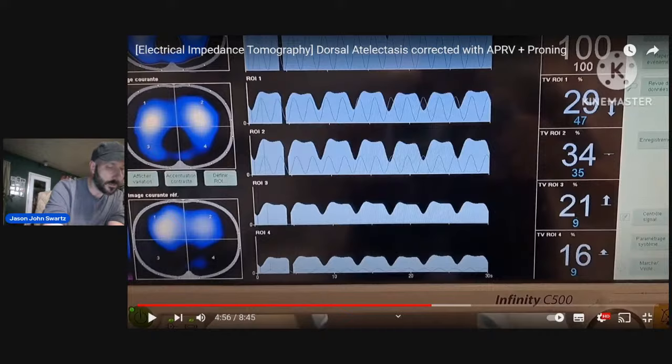When one's family was asking, when I'm talking about rest rate or something, I'm talking about the cycled releases. After the T high, it was a 5-second every one of those releases. That's what I mean. So the patient was just not breathing spontaneously above, and for sure, the patient's prone, so the sedation's deeper. But the patient was super comfortable. We didn't have a rocuronium infusion the whole time. Probably needed a bolus initially.